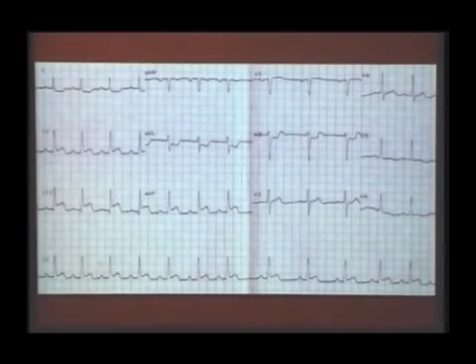So you can see it here, the inferior leads. The ST is elevated here nicely, but the T wave is upright, concavity is maintained. So this is a early hyperacute phase. What is a single sentence diagnosis for this ECG? Acute occlusion of RCA. So once you record the inferior wall elevation, what you must see? V1, V2. V2, you see depression. So what's happening? Posterior infarction.